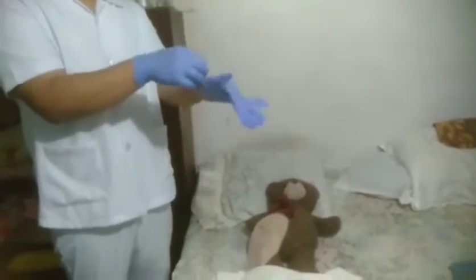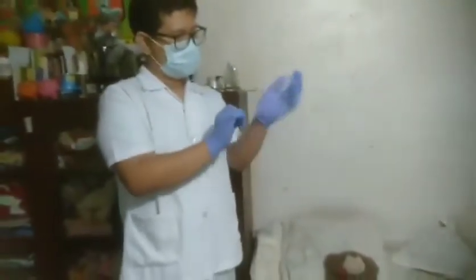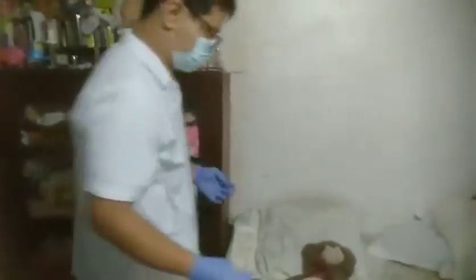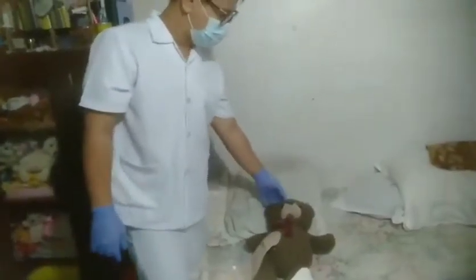Then, if the client is wearing a belt, you fasten the belt if the client is wearing one. And then if the client has many hairs, shave the peristomal skin of a well-established ostomy as needed. Okay, that's why you have the razor. And then after that, you have to make sure that the colostomy is empty and remove the ostomy appliances.